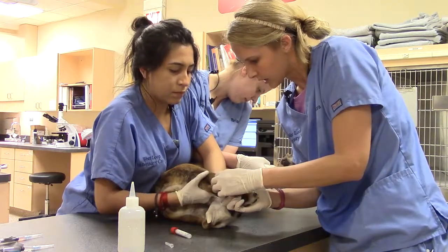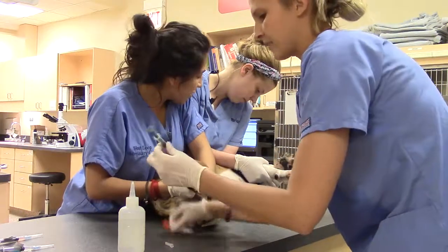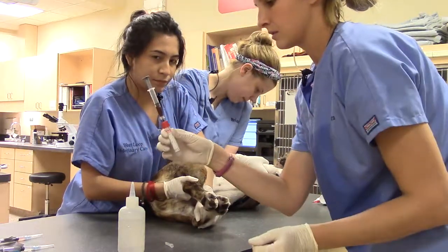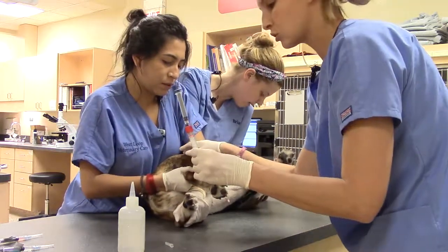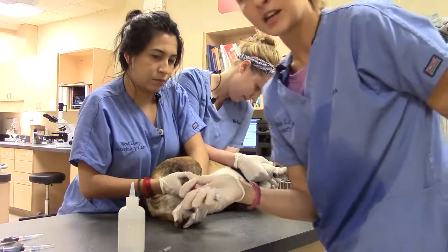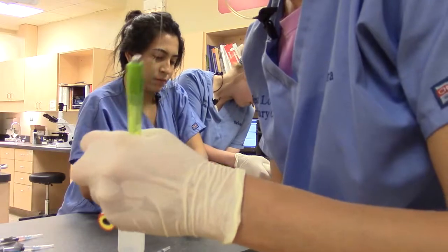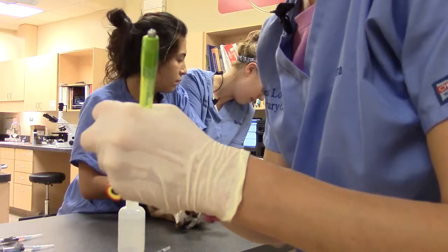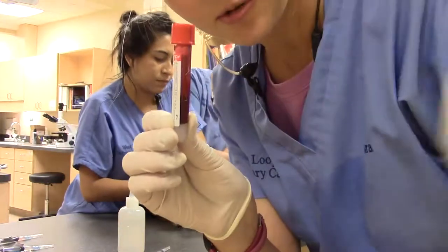She's going to let go and then hold pressure over. Then we'll go ahead and let the vacuum. And then we'll go ahead and put name and date on here, let that sit, and we are all good to go.